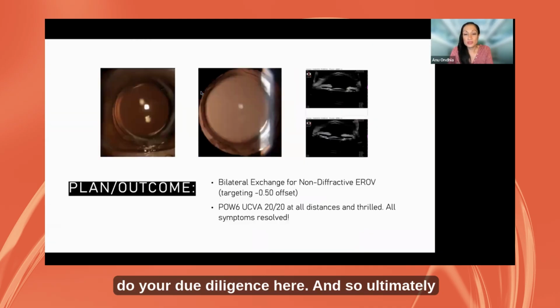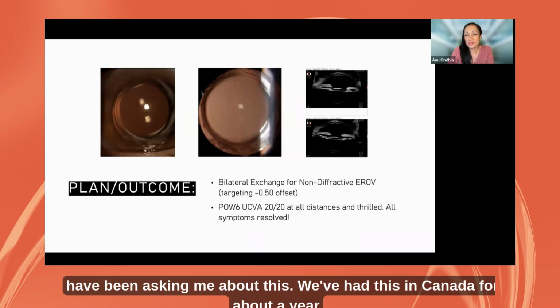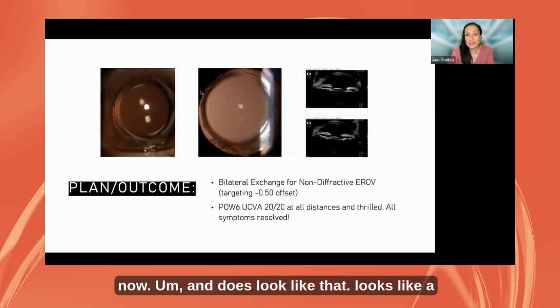And so ultimately for this patient, we did end up doing a bilateral IOL exchange for a non-diffractive EDOF lens. So this particular lens is a Pure C. I know you guys have been asking me about this. We've had this in Canada for about a year now. And it does look like a monofocal.